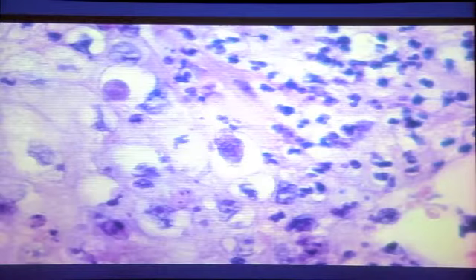And if we look at real higher magnification, you can see some intracellular inclusions in here. These are the viral products of the Parapoxvirus infection. And you see the very dense infiltrate there that's admixed. And this is an electron micrograph. These things kind of look like bread loaf.